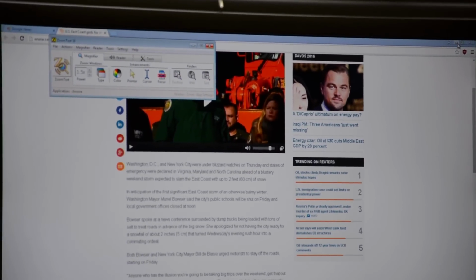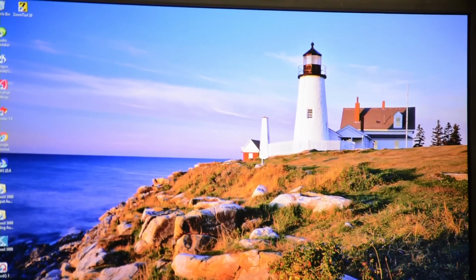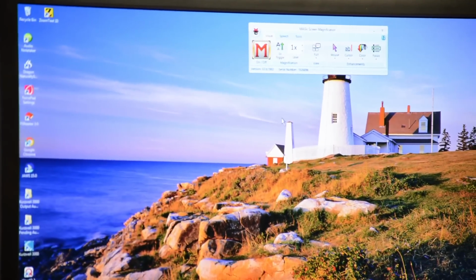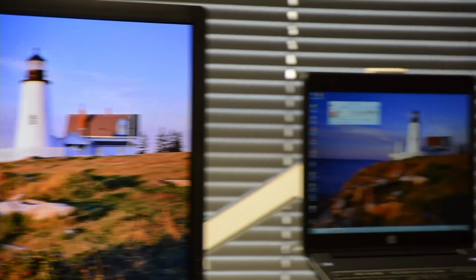So if we launch Magic, you can see they're largely the same. And a lot of people ask, what's the difference, which one should I get? For normal Windows computers that don't have other stuff on them, it seems like they work very well that way. And then sometimes I've noticed that some USDA agencies, depending which agency you're with, or this could be different if you're not with USDA, IT could be running other security software in the background, and some of them might interfere with it.